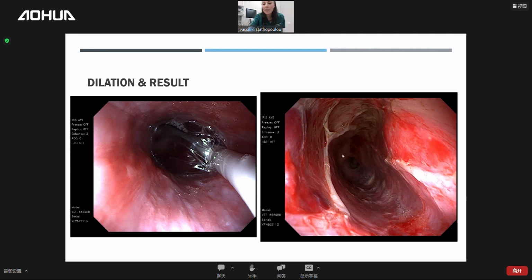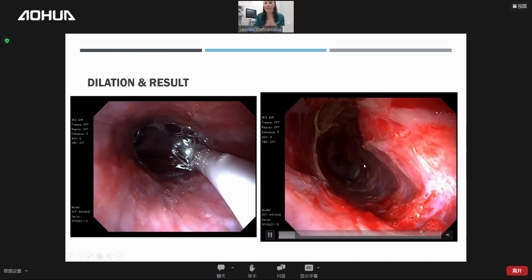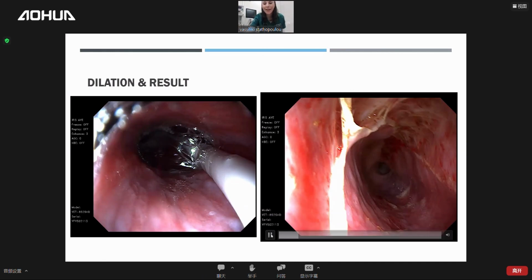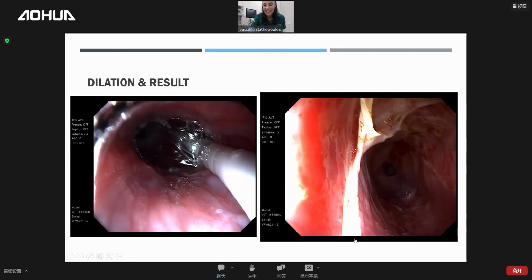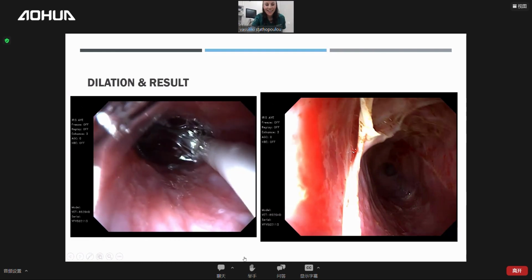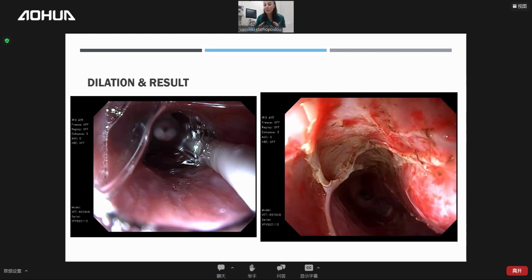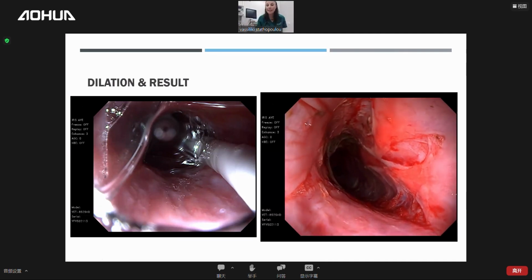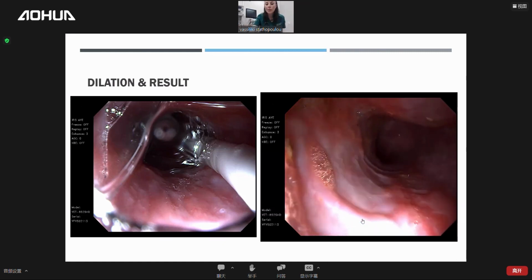And this is the kind of tearing that we caused with our balloon. This is huge here. Can everybody see me now and see my videos? Please answer in the chat. Thank you for confirming. So you can see how huge a tearing that was. We go back and forth with the scope. This is really, really scary. If you see it in a picture, you can see how big a tearing this is. Okay, now we're back, and you can see that the rest of the lumen has a very normal mucosa as well.